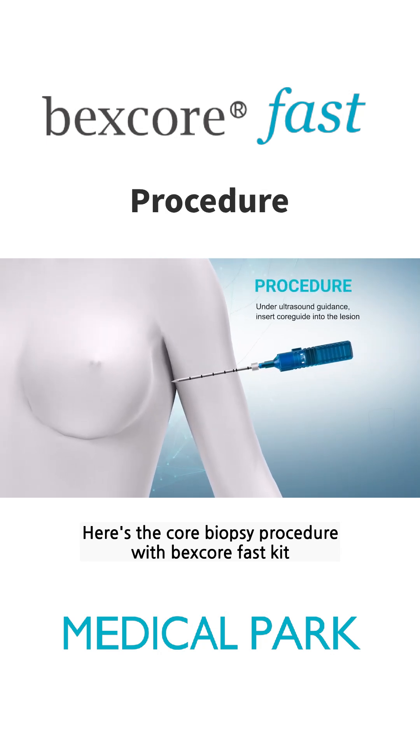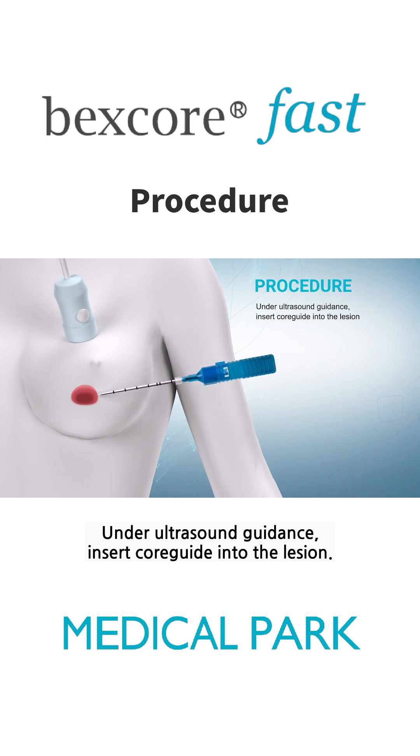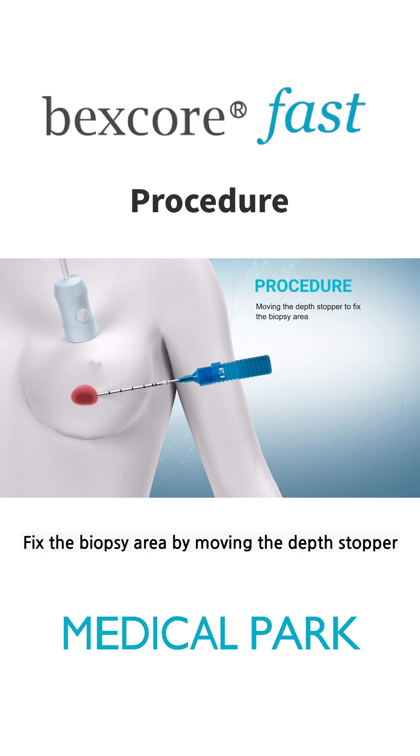Here's the core biopsy procedure with Bexscore Fast Kit. Under ultrasound guidance, insert core guide into the lesion. Fix the biopsy area by moving the depth stopper. Push the button and remove the stylet.